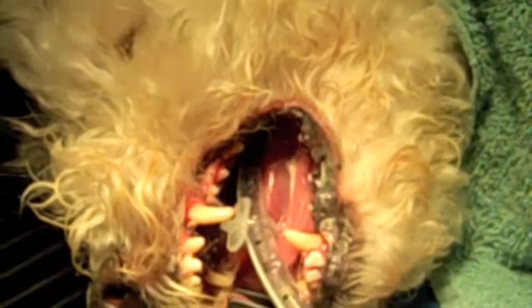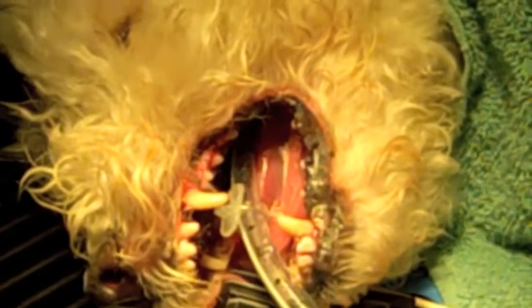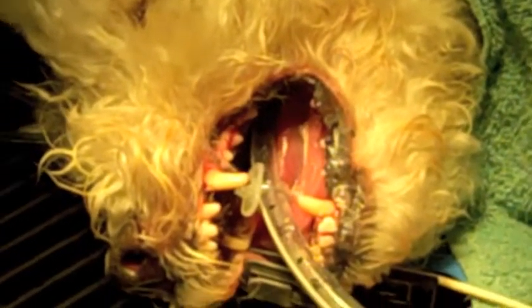And again, I'm going to do the insides of the other teeth, which is just hard to catch on video, so we're going to stop the video and then we'll just come back to show you what the fluoride application is at the end.